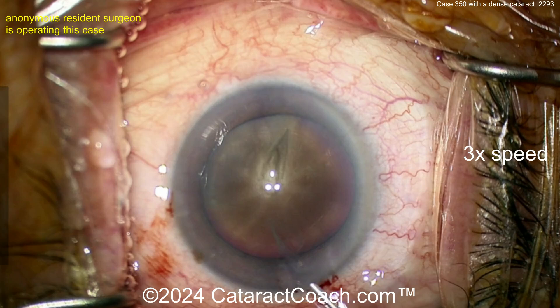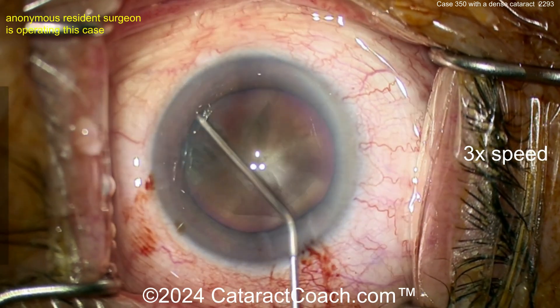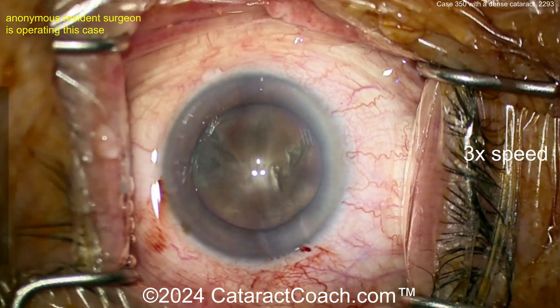Just so you can get this big chunky dense nucleus out of the bag. Here we go — a little hydrodissection. Hard to see the fluid wave because the nucleus is so opaque. Video is sped up at three times normal speed so we can get through at a reasonable time.